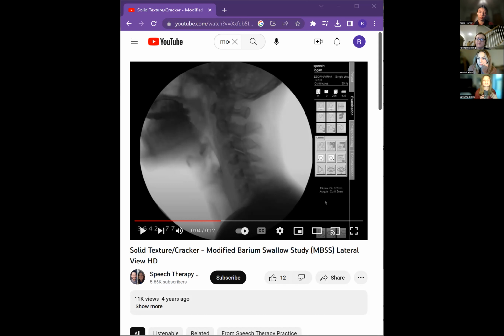So, does the radiation from the X-ray for this study hurt her? No, so the radiology would not have any lasting effects. It's kind of the same as getting any other X-ray. So it's just a normal radiation amount from the X-ray. Oh, okay, awesome. And one last question.